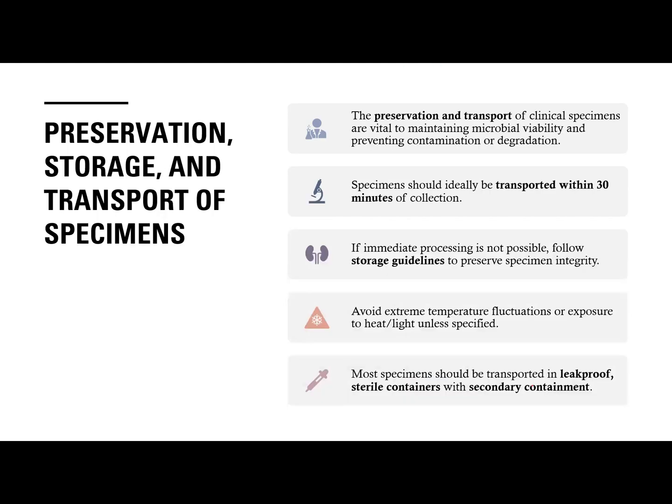Now let's talk about preservation and storage, class. So very important to maintain bacterial or microbial viability. So gusto mo na mabubuhay, let's say ang request is culture. Pag culture, class, you want to propagate the bacteria. And it's very important that in cases that there are delays in transport, you could preserve their viability, yung ability nila mabuhay, class. Now, specimens, class, in most situations are ideally transported within 30 minutes of collection. So, dapat within 30 minutes, nasa iyo na yan.